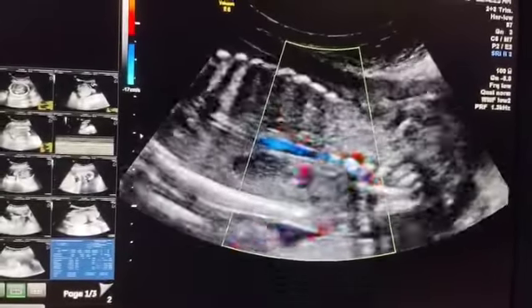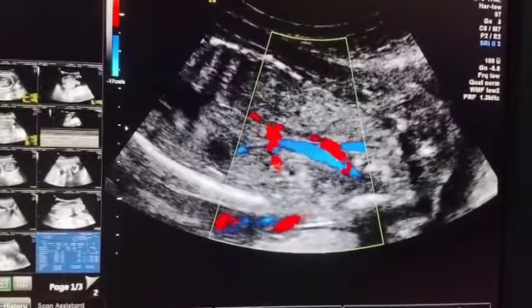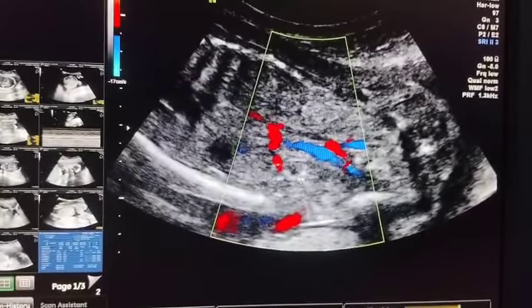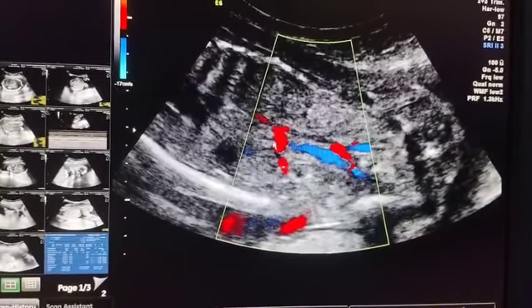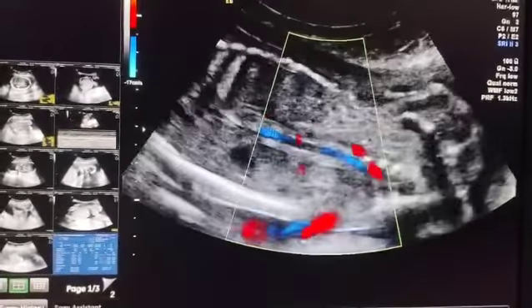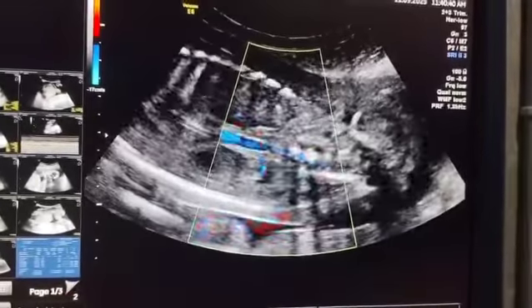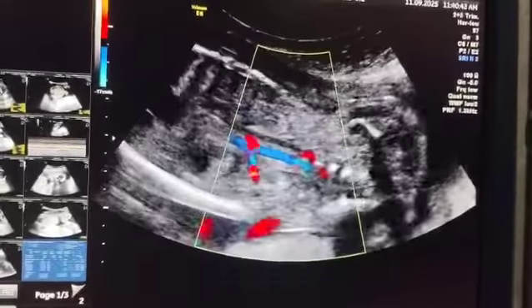So it's a unilateral kidney which is a little larger. This is the renal echoes, this whole length, and this is the renal artery. This is how we need to assess the kidneys in all the three planes during our assessment.